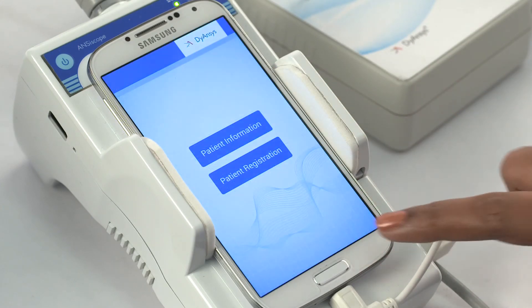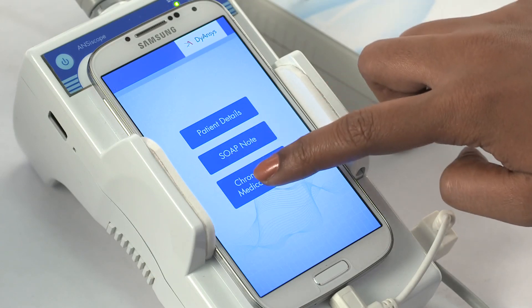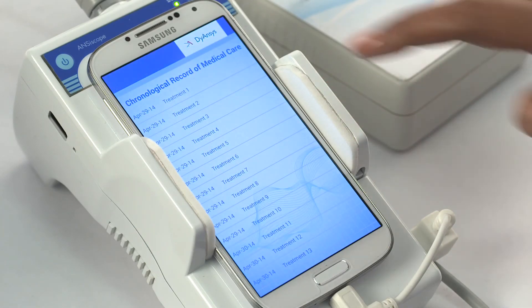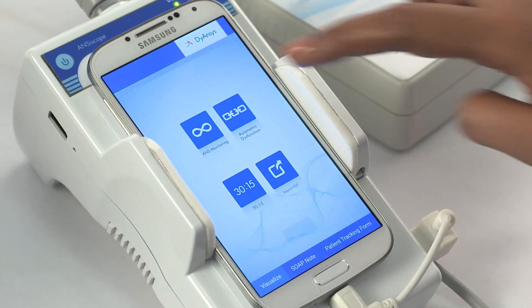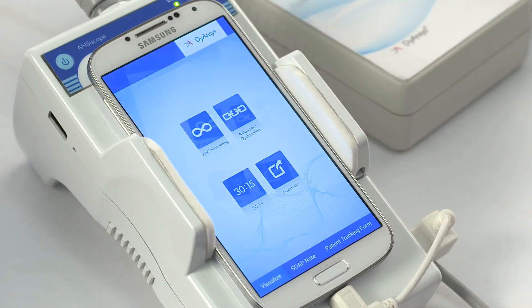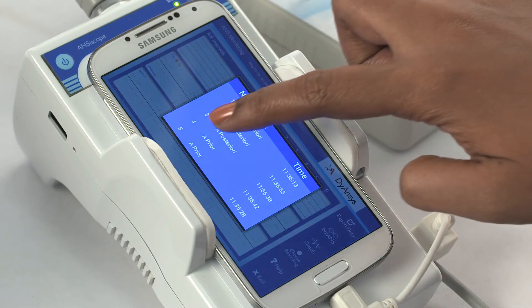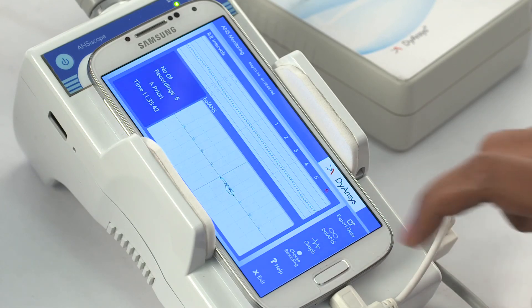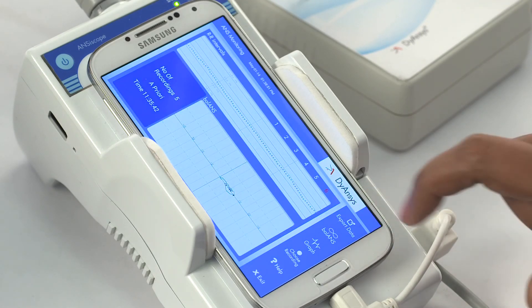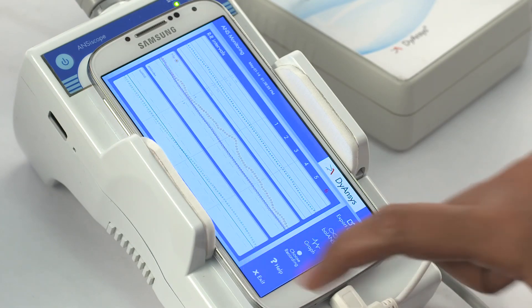Then go back twice. Select chronological medical record. Select the treatment per the treatment number and date performed. Select ANS monitoring and press choose record to select the measurement based on the time of day it was performed. Press export data to save data as a PDF. Exit the screen.